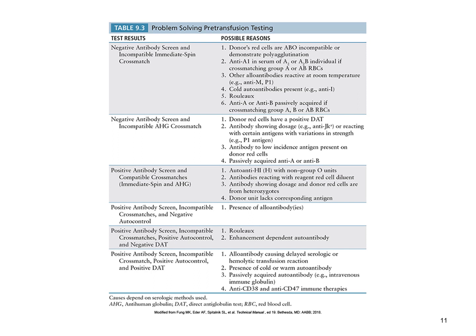Because when you look at it in a tube test, it looks like it's not going to work. But when the patient is in dire need of an actual transfusion and they're having complications and they need that unit of blood, you're just hoping that the benefit outweighs the risk in that particular situation.